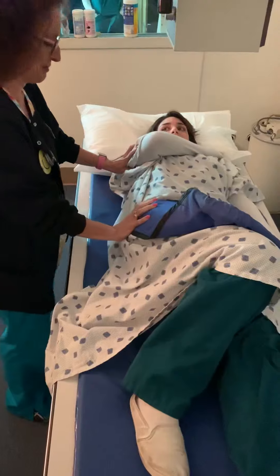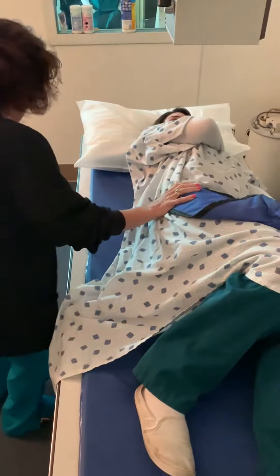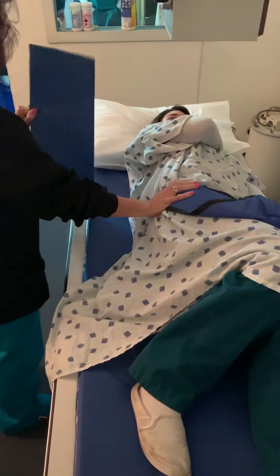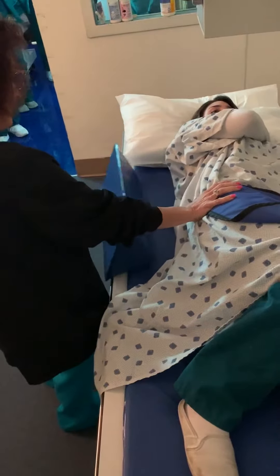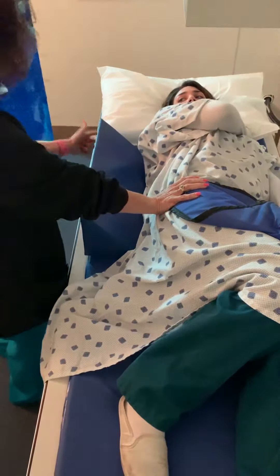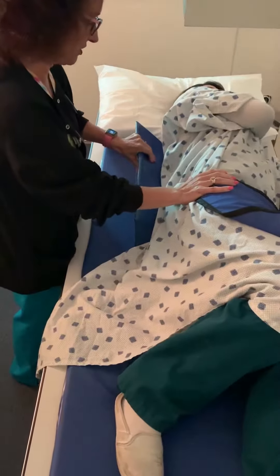Don't shift your hips, which is what every patient starts to do. So she's going to roll up. The way the sponge works, you have different angles on here — you want this widest part underneath her so that that's a 45-degree angle right here. Right here is a 45-degree angle. So I'm going to roll her up and put this under her.